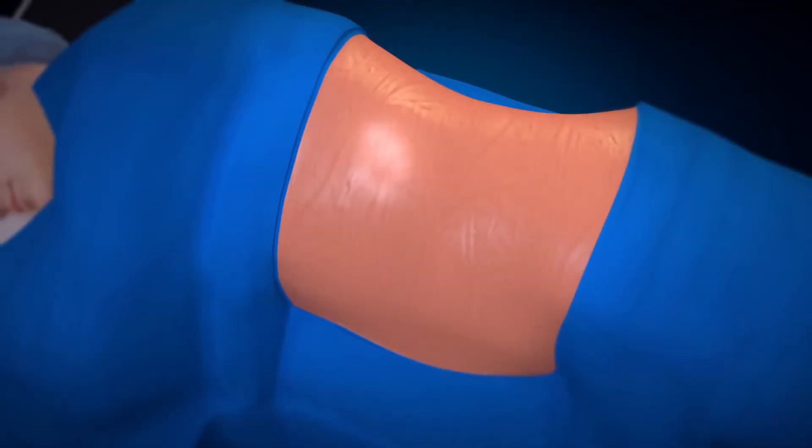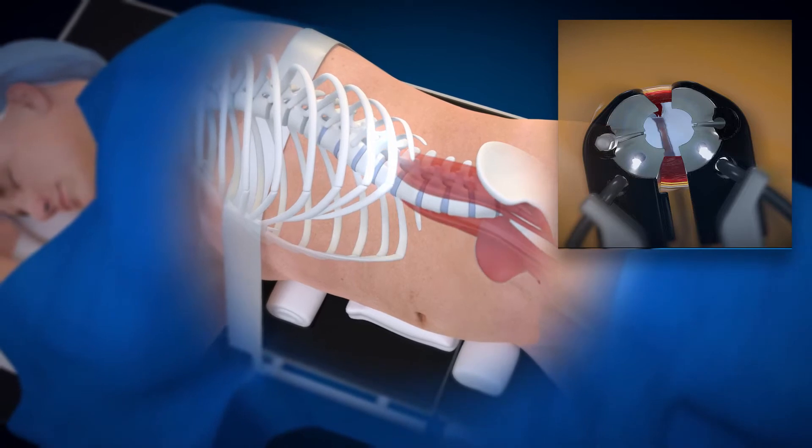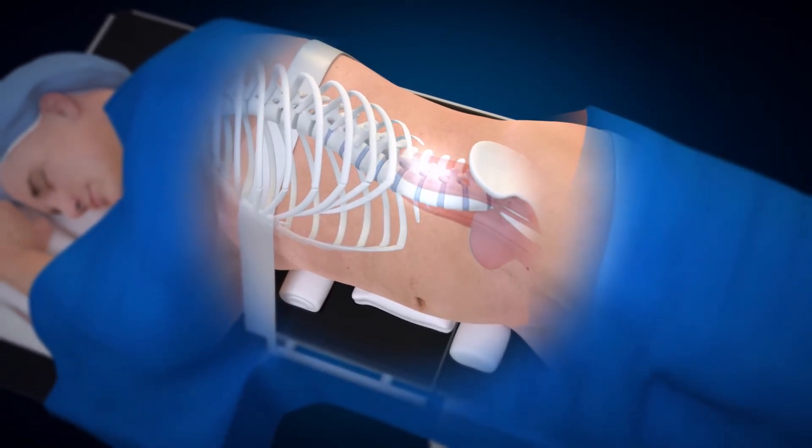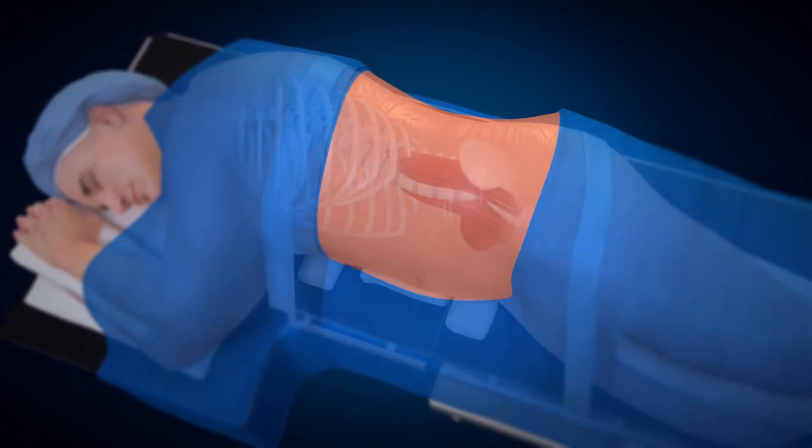The OLIF-25 procedure is a muscle-sparing approach through an oblique corridor to access multiple levels of the lower lumbar spine. When considering an oblique approach, we must consider the anatomy.